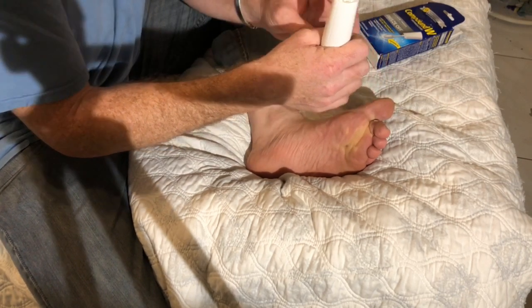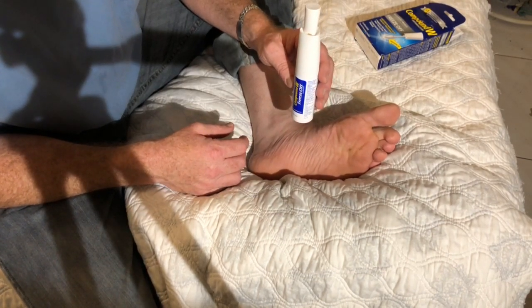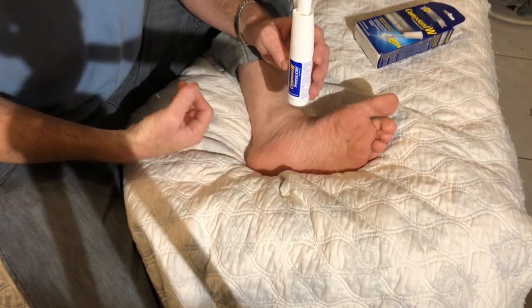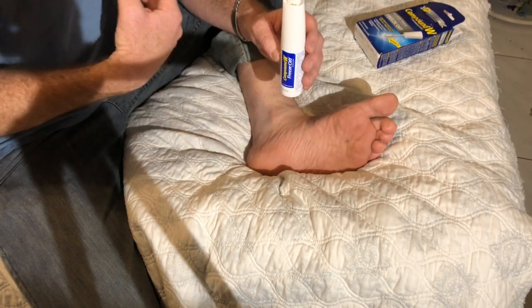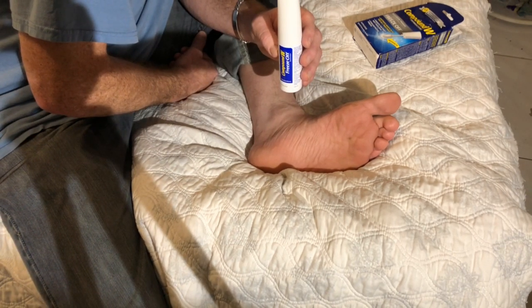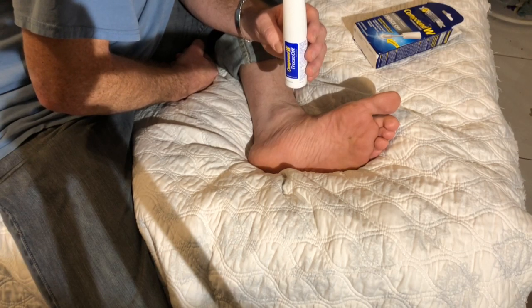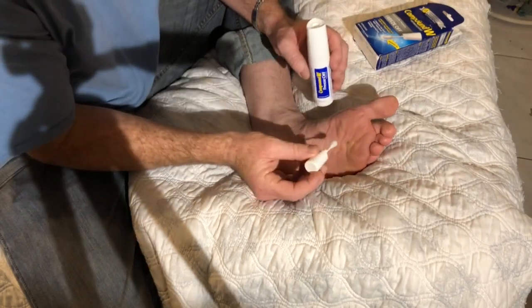Counting out 30 seconds for the first stage of the application: 1, 2, 3... counting up to 30 seconds.